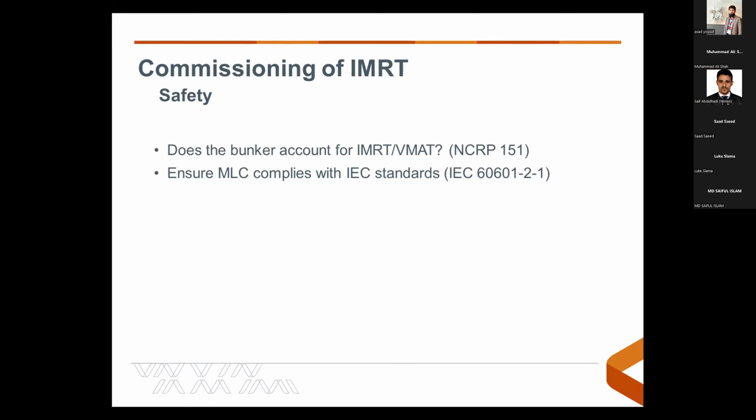You also need to ensure that the MLC complies with the IEC standards for electrical, mechanical, and radiation safety. So these are IEC 60601-2-1.